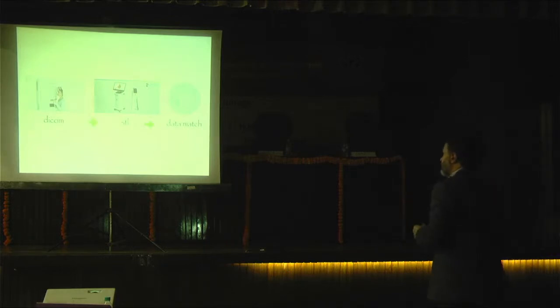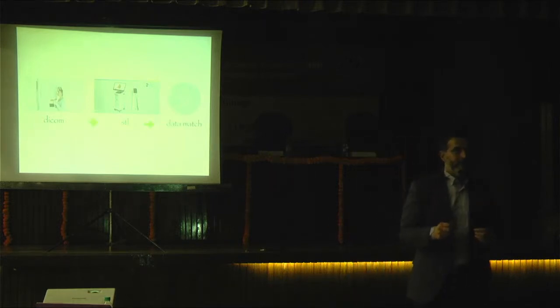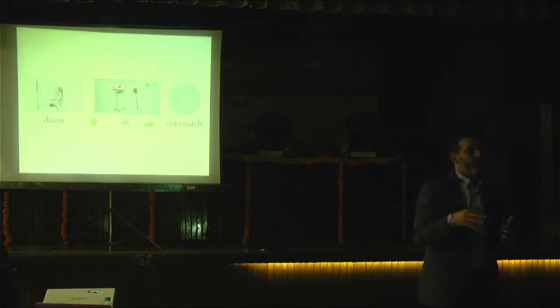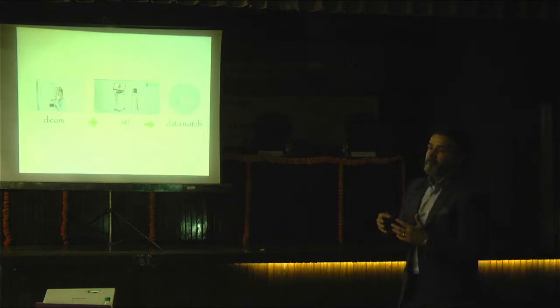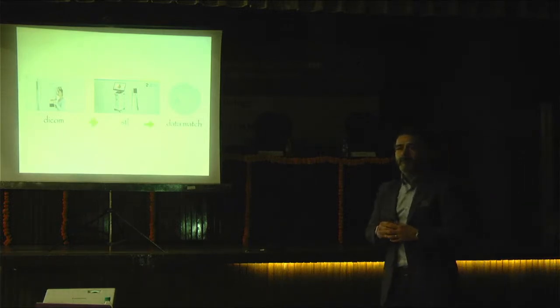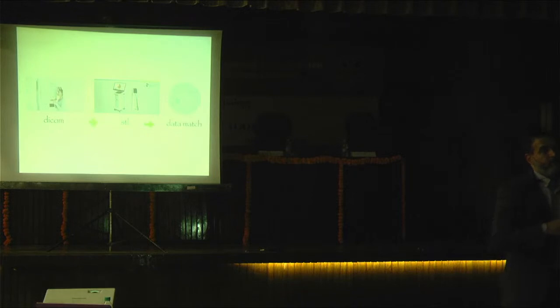And the last thing, the STL file, which I use in my clinic. I make the oral scanning, and I get everything without impression. But it is not so important. You can take an impression. We have so many qualified impression materials. And for this dental college, maybe the dean will help, and you're going to buy an extraoral scanner, and by the help of this machine, you can get the STL data of everything, not only about teeth. You can do whatever you want after getting the extraoral scanning.